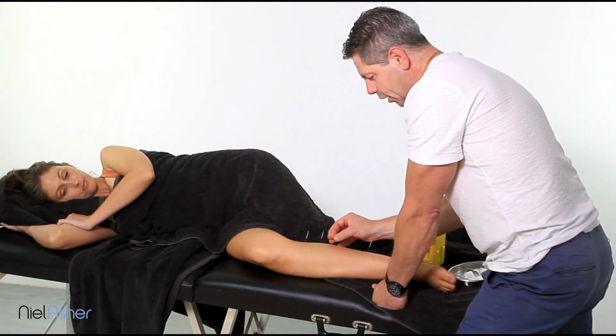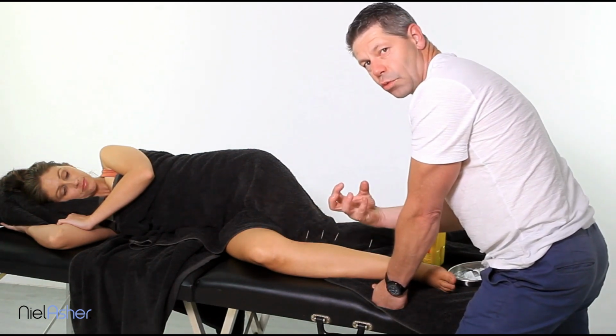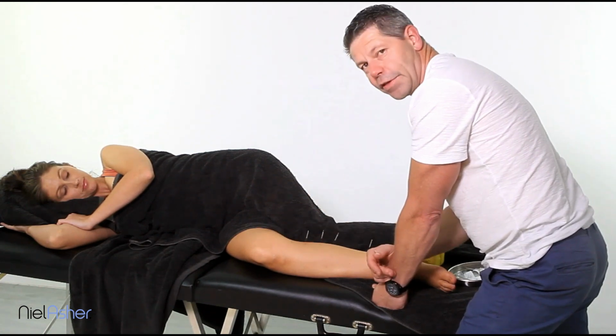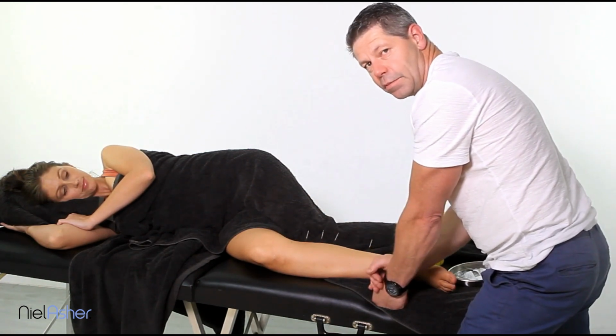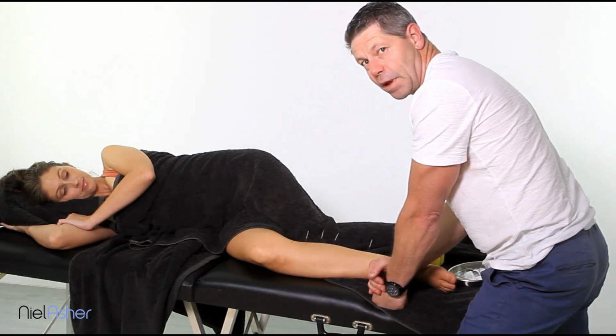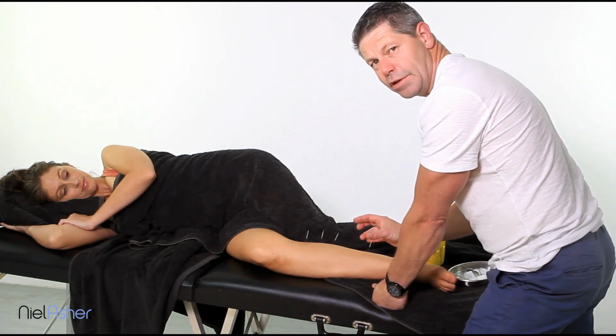Okay, we're going to check these on 3-minute intervals. If there's still strong referral or really strong dull aching pain, then leave them for another 2 minutes and then check them intermittently about every 2 minutes. So you can leave these in anywhere from 10, 15, maybe even 20 minutes sometimes. All right, so that's needling for the medial compartment for shin splints.